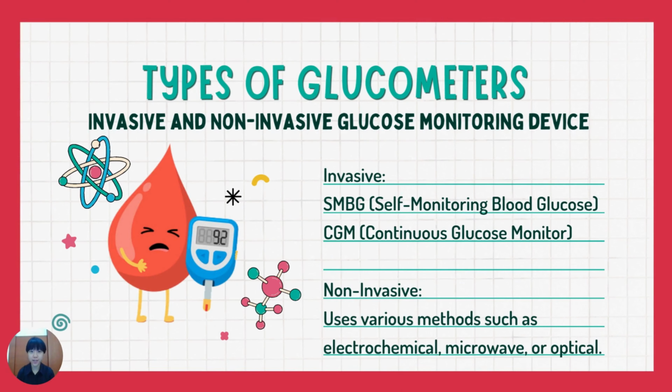Thank you for the opportunity. My name is Sienny Kuswardi and the last 3 digits of my student number are 004. I'm now going to explain the types of glucometers. Generally, they can be divided into 2: self-monitoring blood glucose, or SMBG, and continuous glucose monitor, or CGM.